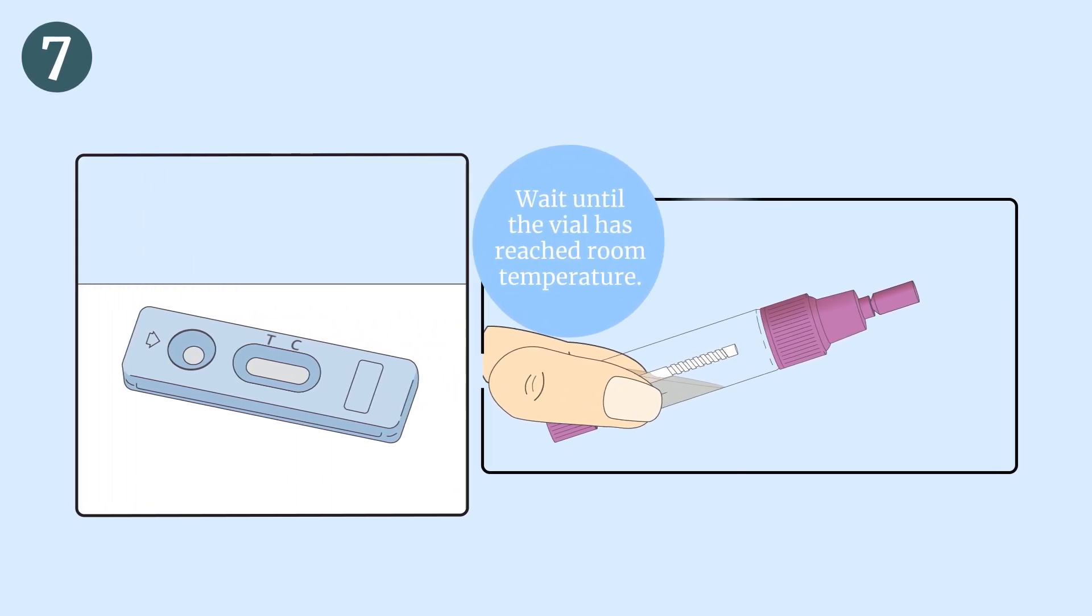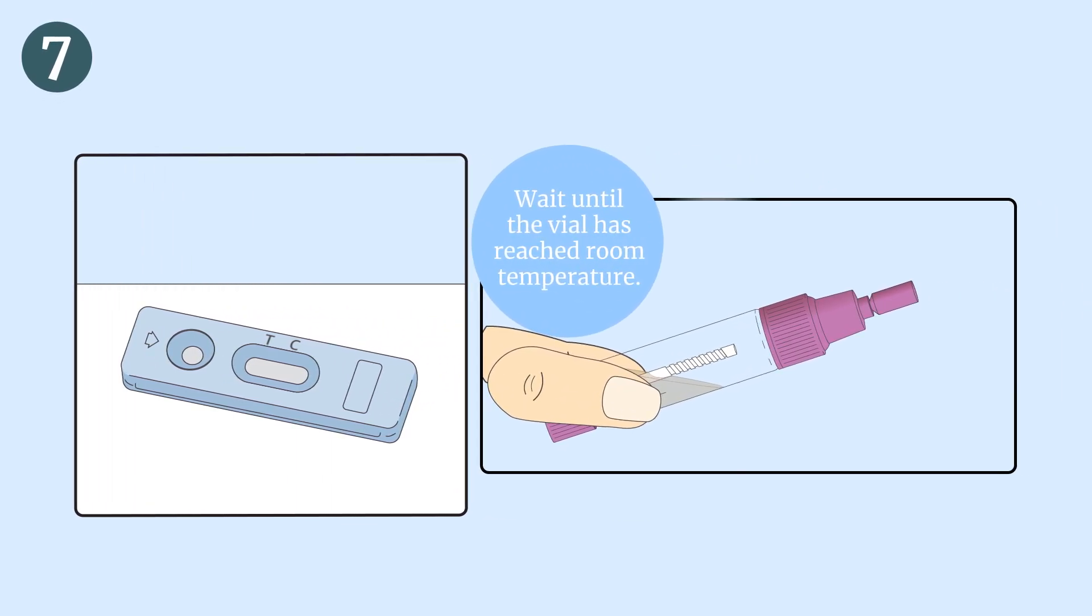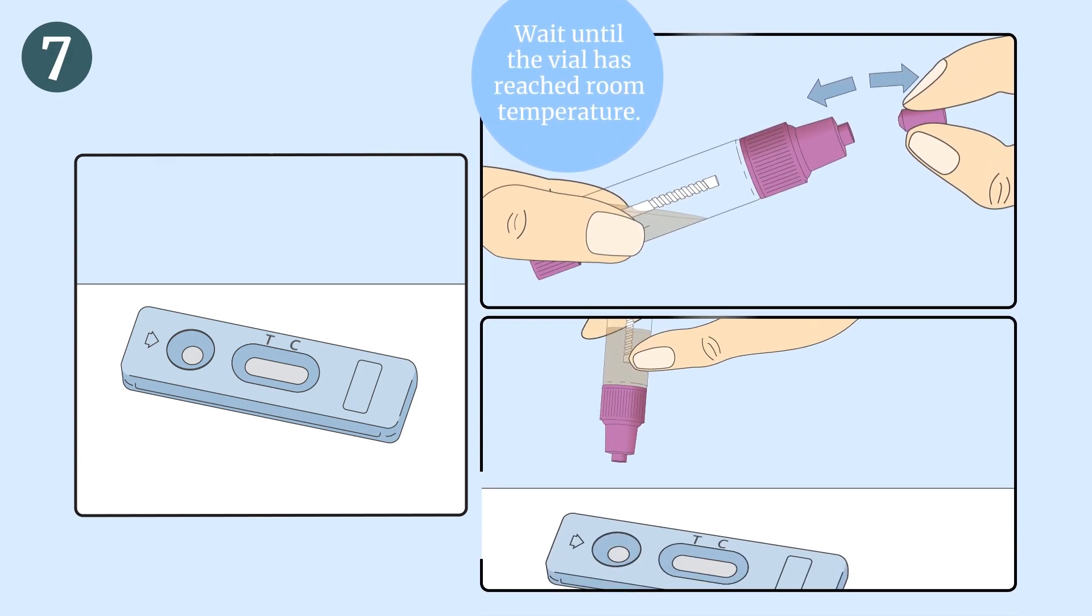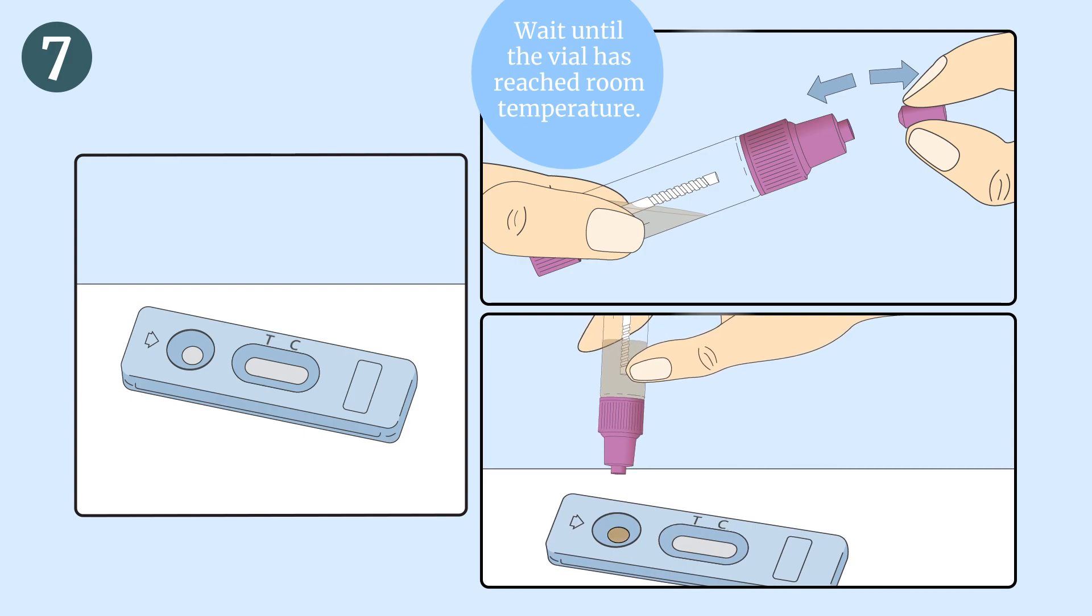Wait for the sample dilution vial to reach room temperature before performing the test, then proceed to break the purple tip. Place the test device on a flat surface and press the vial body to add exactly five drops of the extract, with an interval of two to three seconds between each drop, into the sample well.